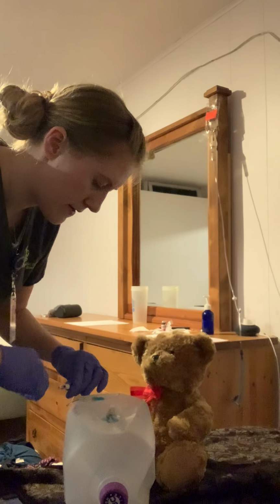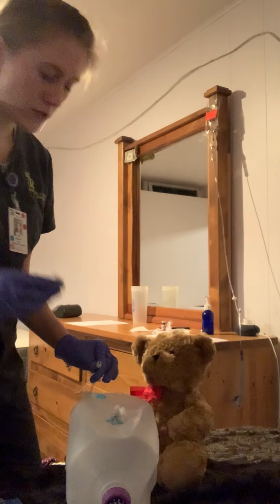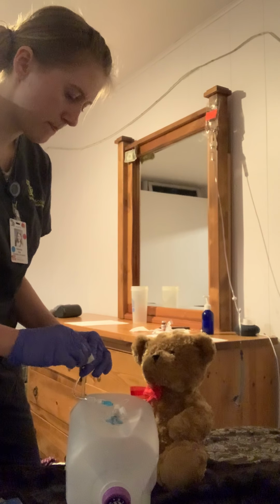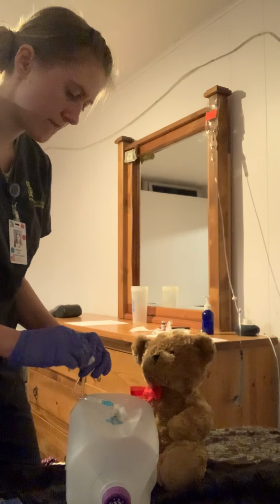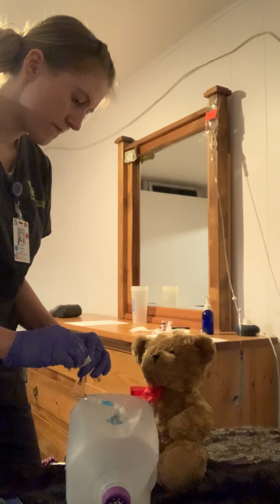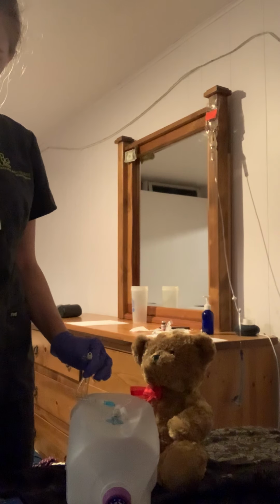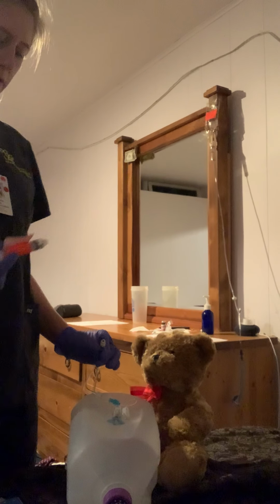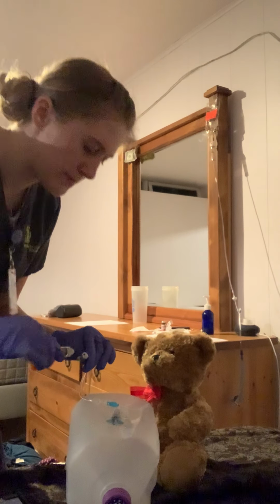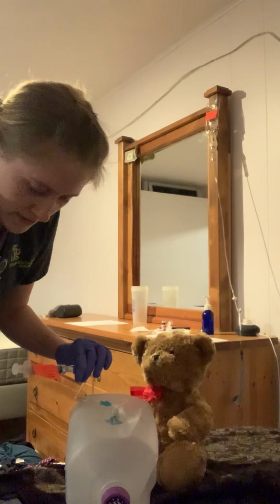All right, uncap that. This one's empty. Now again, another alcohol swab, keeping it clamped, 15 seconds. And then just letting that dry. Now I have my furosemide here. And again, it's 1 mil every 15 seconds, and we'll do the stop push method. Okay, so I'm gonna hit my timer here.